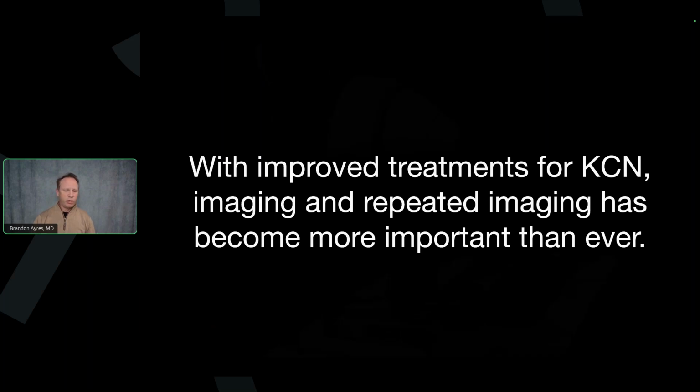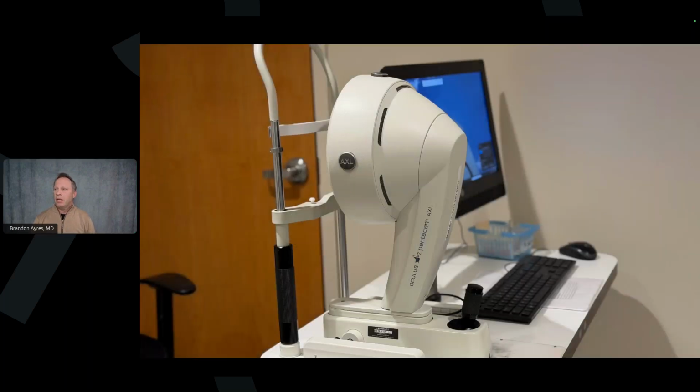Central to this really is the Pentacam. I think our office basically revolves around Pentacam measurements, and my technical staff just get a Pentacam on everybody. I'm like, well, I probably didn't need one on this patient, but thanks for getting it. But with keratoconus, every visit is a Pentacam. When I'm having a huddle with my technical staff, I say, when in doubt, if somebody comes in and you think they have keratoconus, they have a story that sounds like keratoconus, or they say something is misshapen with their retina, because they always come in saying their retina has got something messed up, and I don't know why they're seeing a cornea specialist, it's probably the cornea, get that Pentacam.